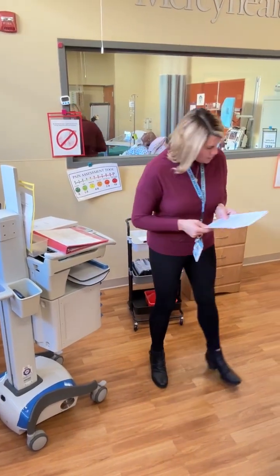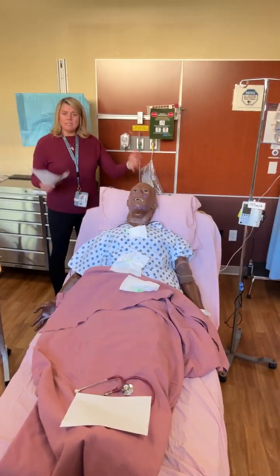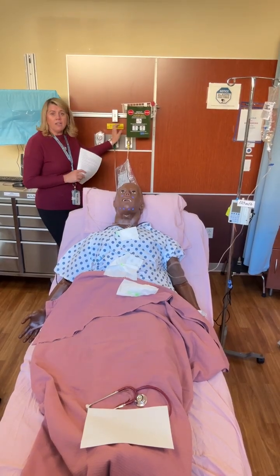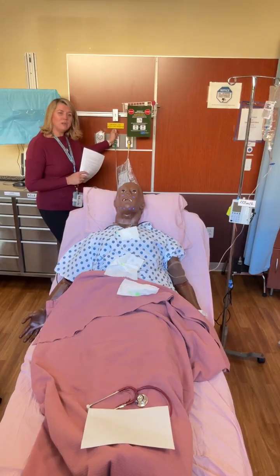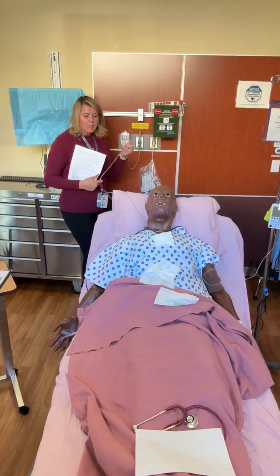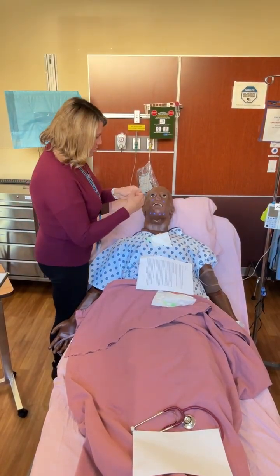All right, to the head walls. So we've talked about how the bed can go up and down and stuff like that. You have head walls here. Head walls are at the head of the bed. It's a wall and it has stuff on it. So you have your air flow meter, your oxygen flow meter, and your suctioning. In the event that you need to put oxygen on the patient, he has oxygen here. You can actually put it in his nose, like you were expected to do in real life.